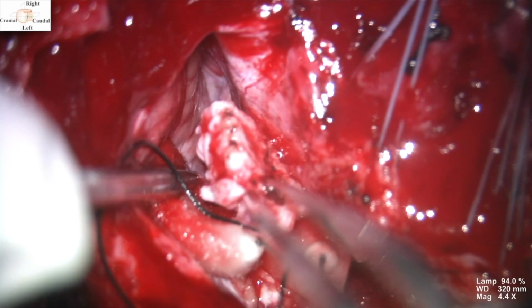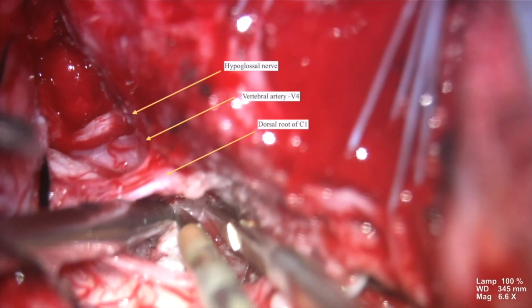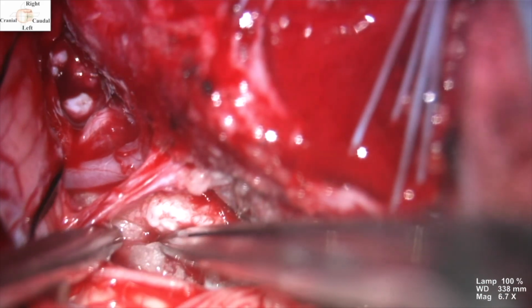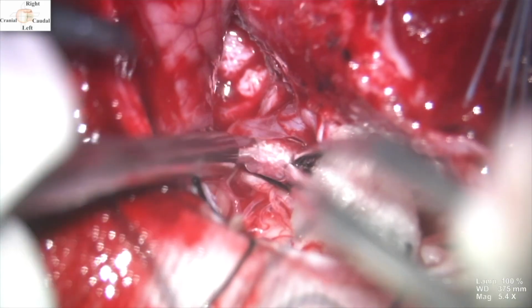Following debulking, the V4 segment of right vertebral artery was clearly visualized. The tumor was then dissected away from the artery by working through the surgical corridor on either side of the dorsal nerve root of C1 and the vertebral artery.